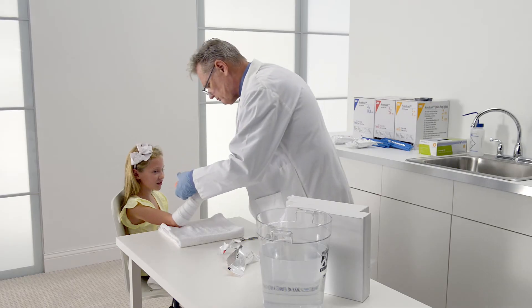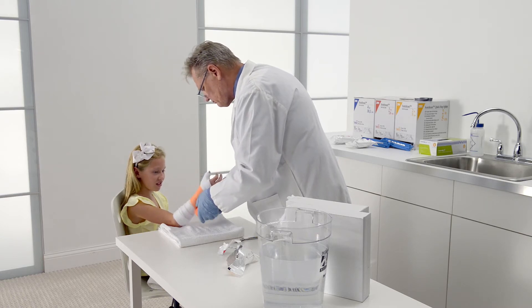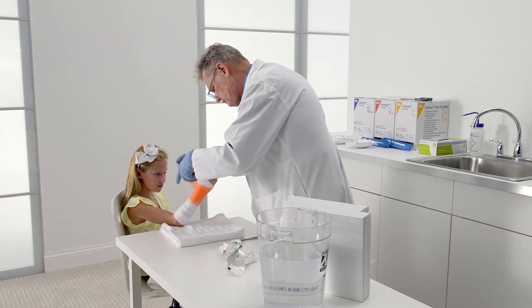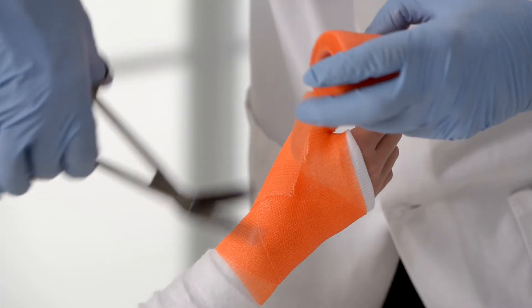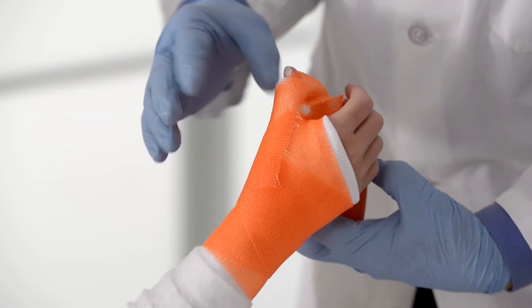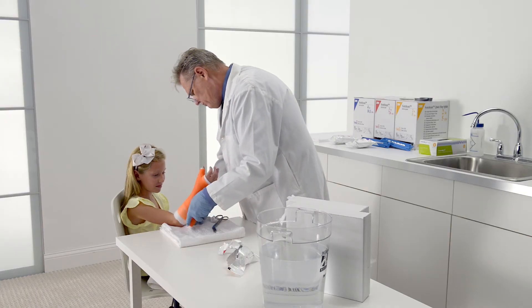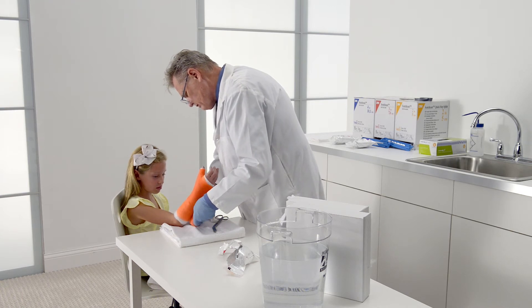It's now casting time using 3M Scotch Cast Plus Casting Tape. Put on examination gloves to protect your skin from cast resin. The first half of the cast will be applied without dipping the roll in water. Follow the pattern of the padding. Roll around the wrist, over the palm. Wrap the thumb twice, cutting the casting tape as you go. Then wrap the palm, working your way up the arm.